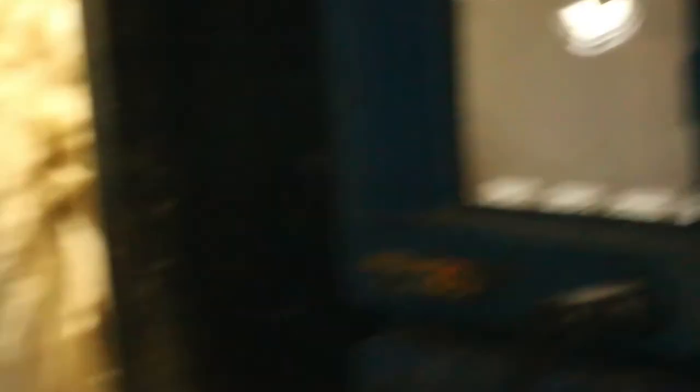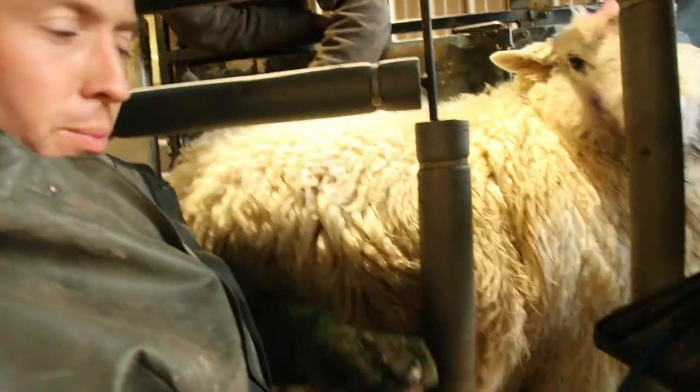I've just put in the probe, sort of pump water through the probe, and the probe produces the ultrasound, and that goes on the skin in between the leg and the udder of the sheep.